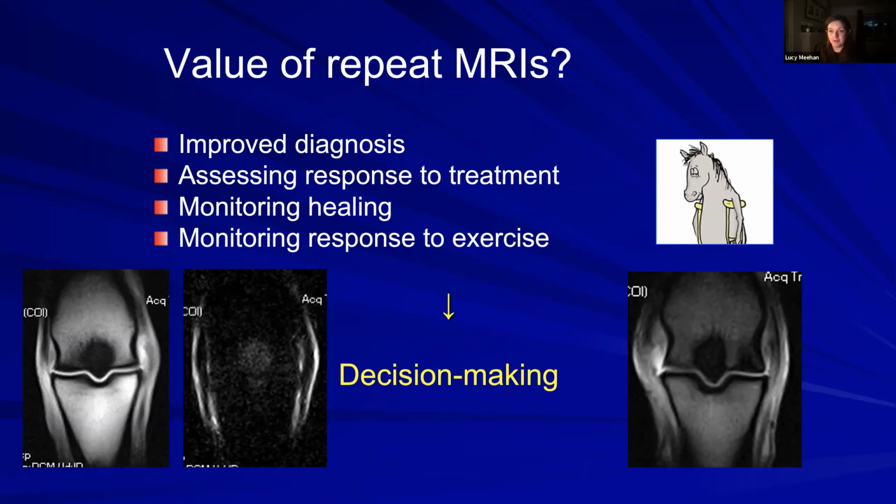I think we're always spending a lot of time looking at the cost benefit analysis of this. Obviously, MRI is a relatively expensive procedure, and we're often looking at a limited budget or trying to get as much as we can for the money. So the follow-up question is, do you discuss or plan the likelihood of repeat MRIs with the owners from the start? And certainly my suspicion would be it's a bit easier in a competition horse population than a leisure horse population.